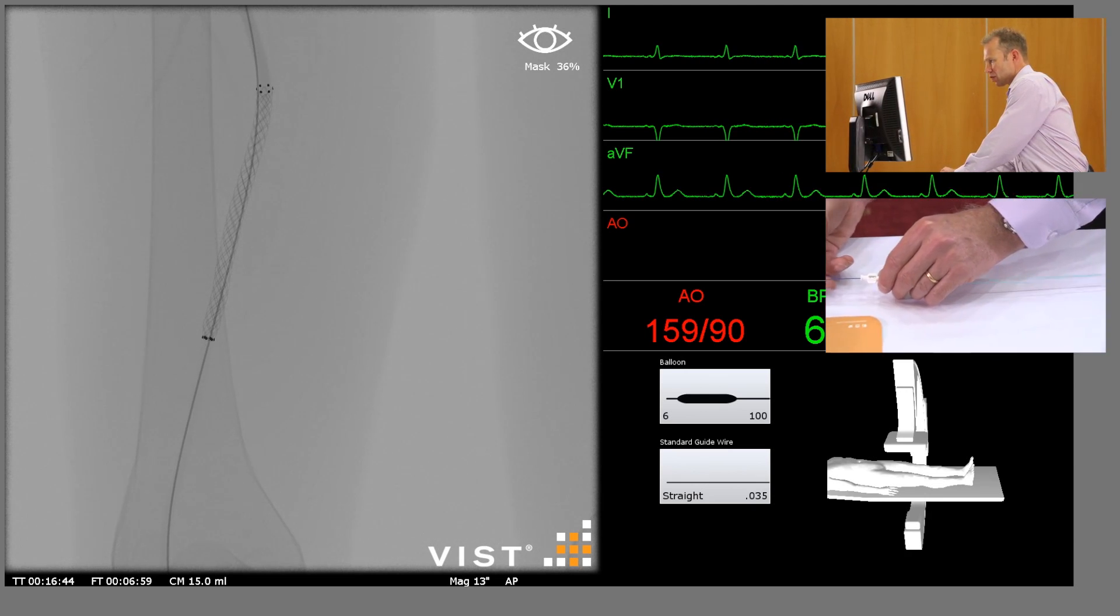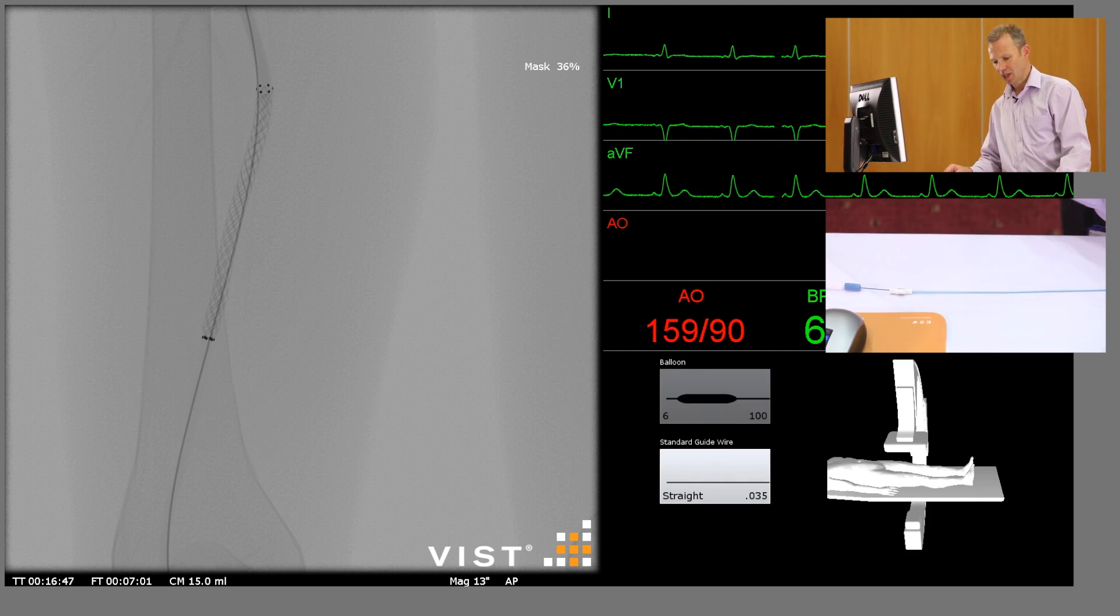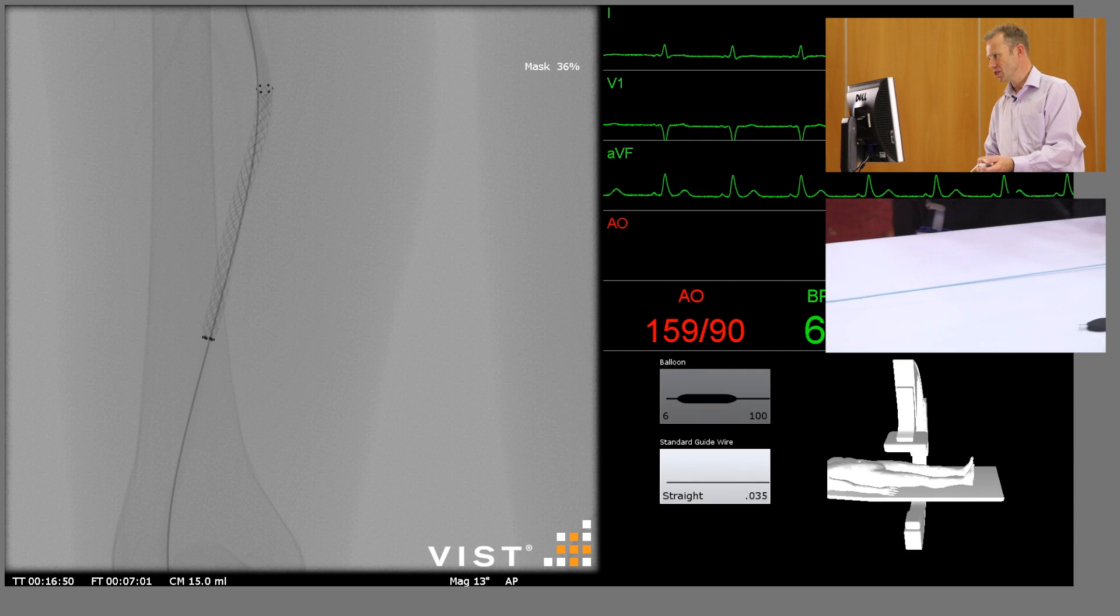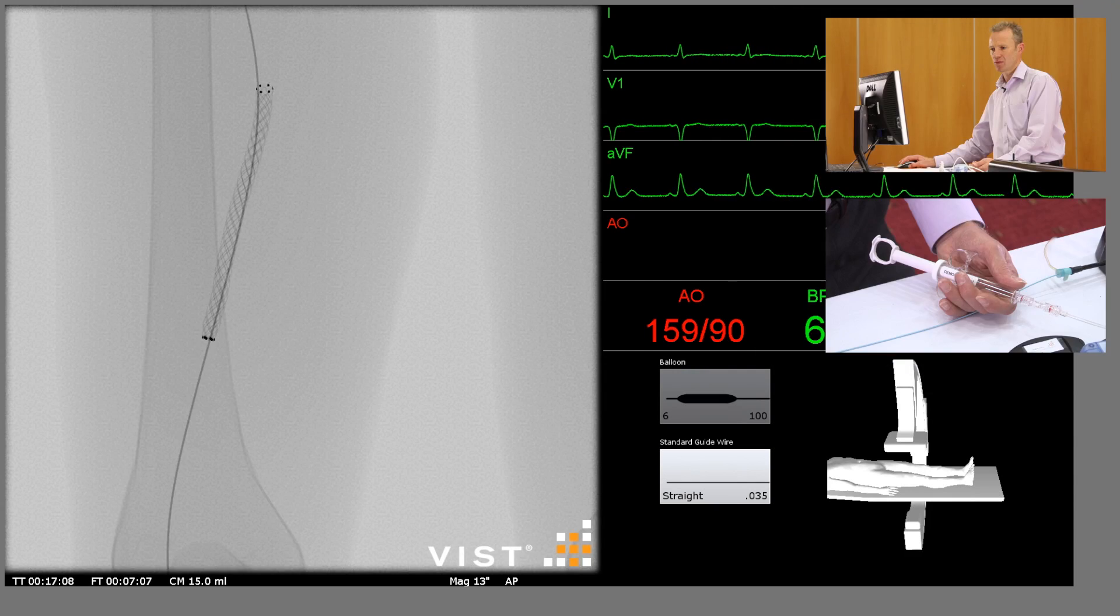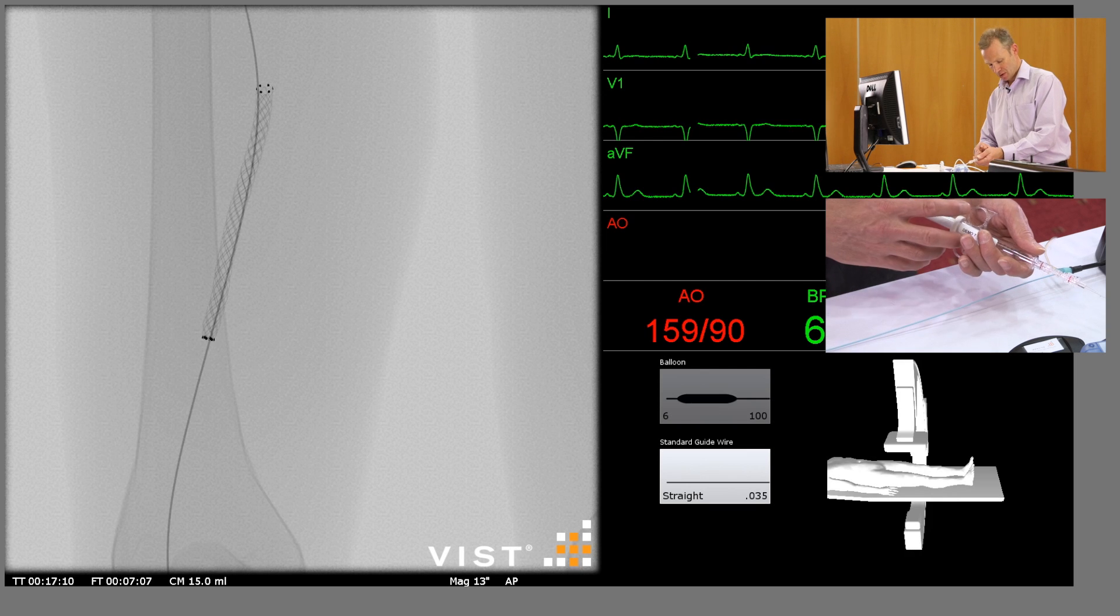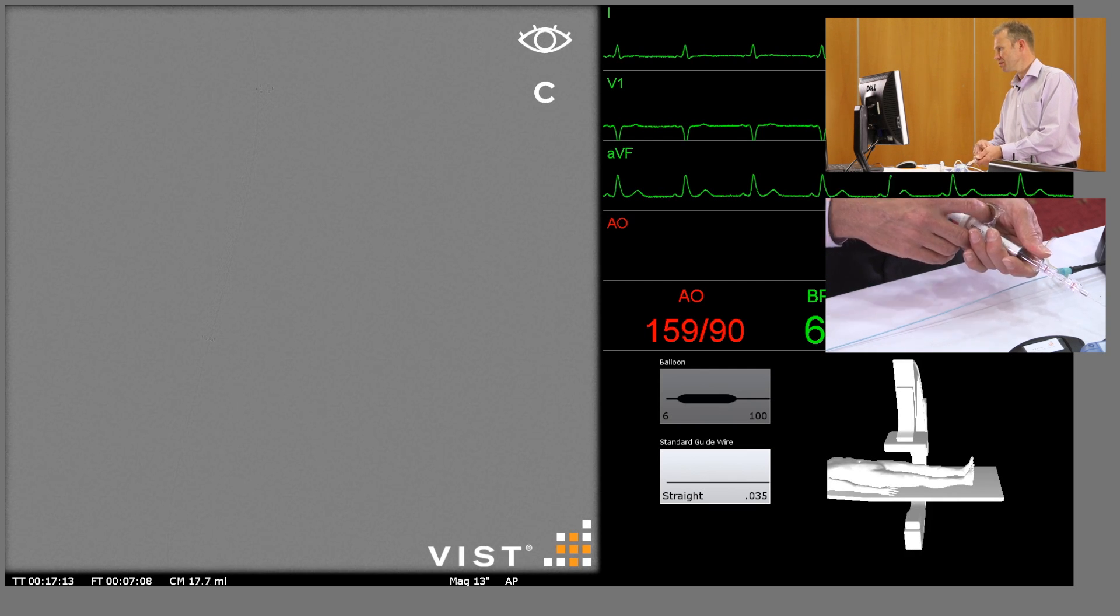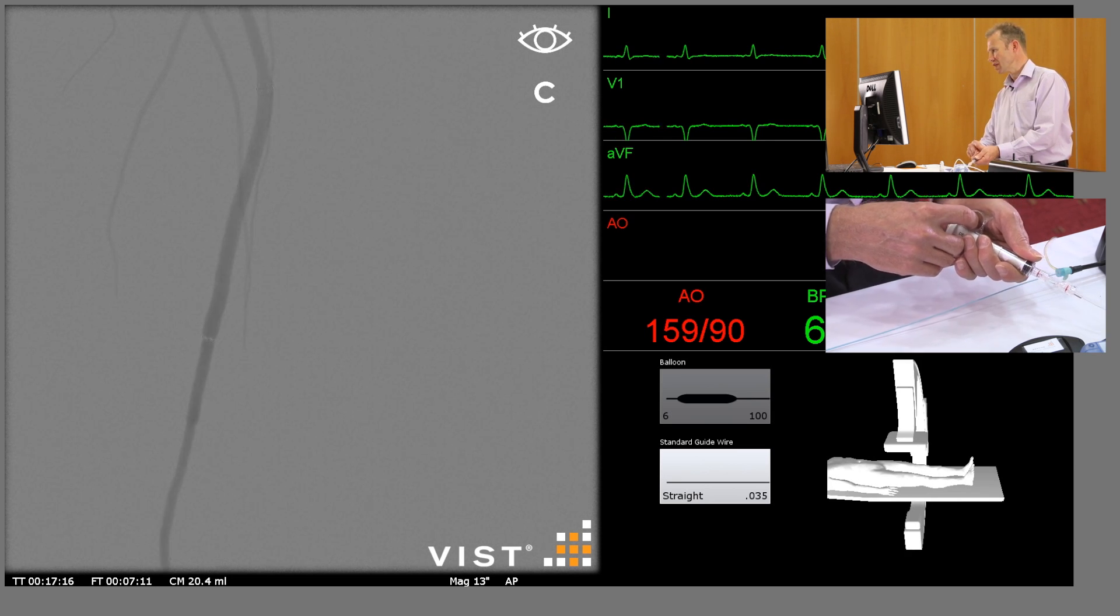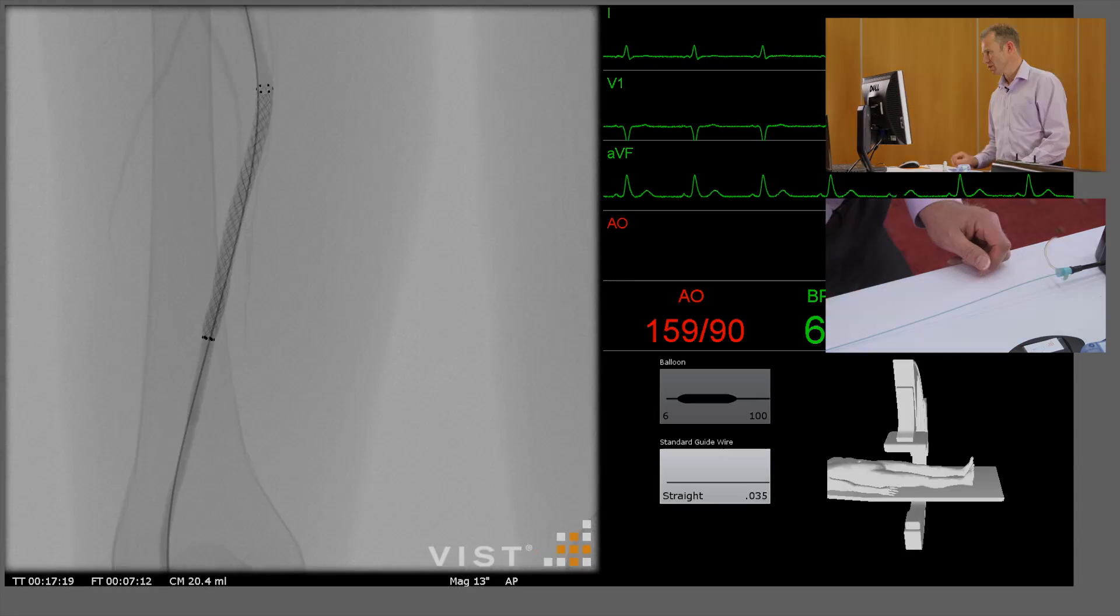Because we've still got an arterial sheath in place, we can now do a diagnostic run and check to see what the result is like. That's given us a good angiographic result.